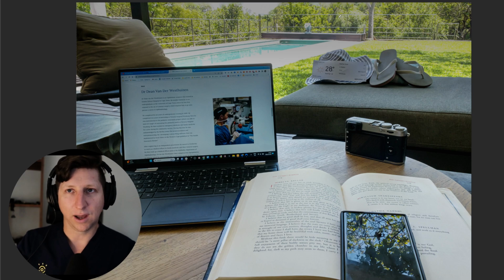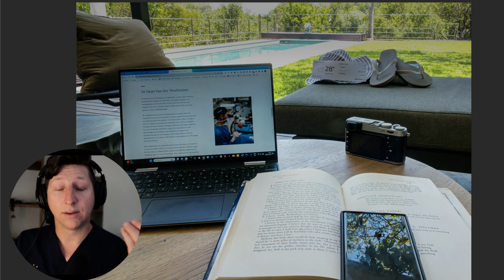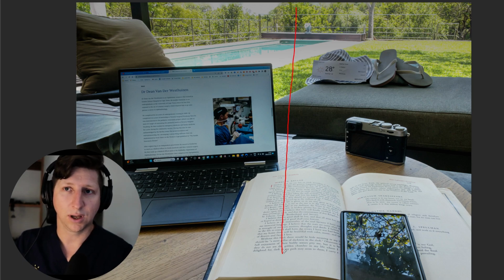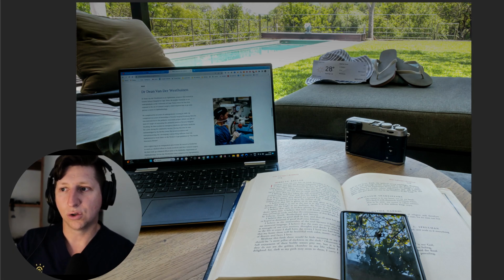So this is the young eye. You can focus on the distance, you can focus on a computer, you can focus on near, you can focus on your phone quite easily. And that is because the lens inside your eye, the natural lens, is able to focus from far to near. Now, when we implant a lens in the eye, it's impossible for us to recreate this scenario, and so there are going to be trade-offs. So I'm going to explain what those trade-offs are, so you can make a better decision on what lens to choose for yourself. So let's first talk about a cataract.